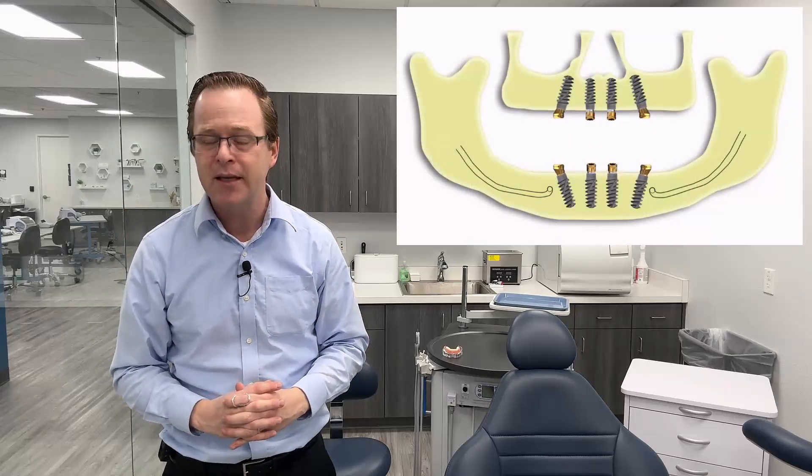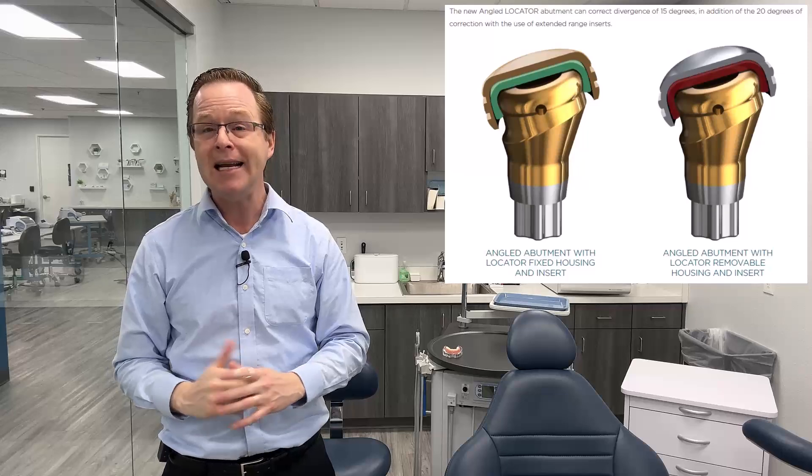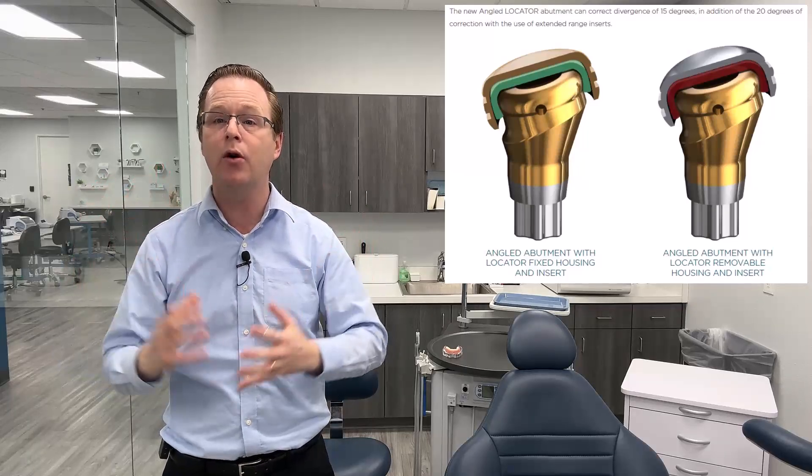Where historically I would have to tilt my locator just a little bit, possibly angle-correct with locator RTX or use a multi-unit abutment — but now, with locator angled, I can use the original locator abutment with the angled 15-degree pre-angled connection. You heard that right: 15 degrees. It's really wonderful for the anterior maxilla as well as the posterior arches. Zest is saying we can angle-correct up to 35 degrees. That's really incredible, and we achieve that because the angled abutment is 15 degrees by itself, and then we combine locator angled with extended range locator inserts.